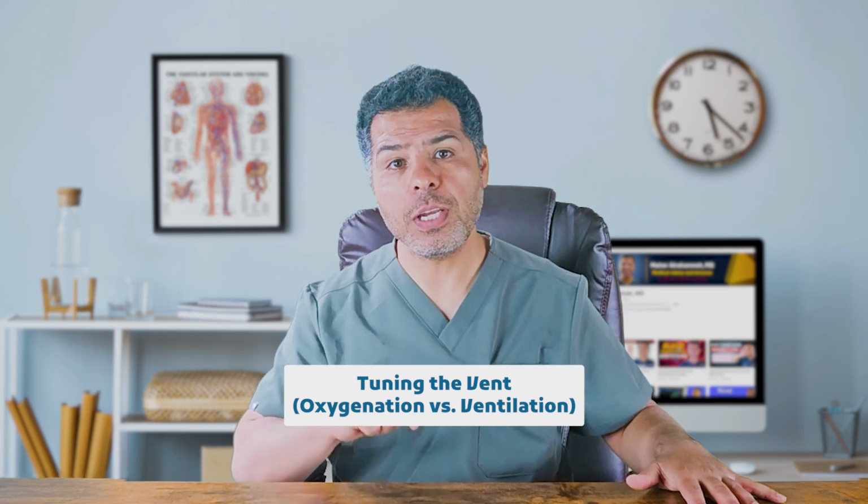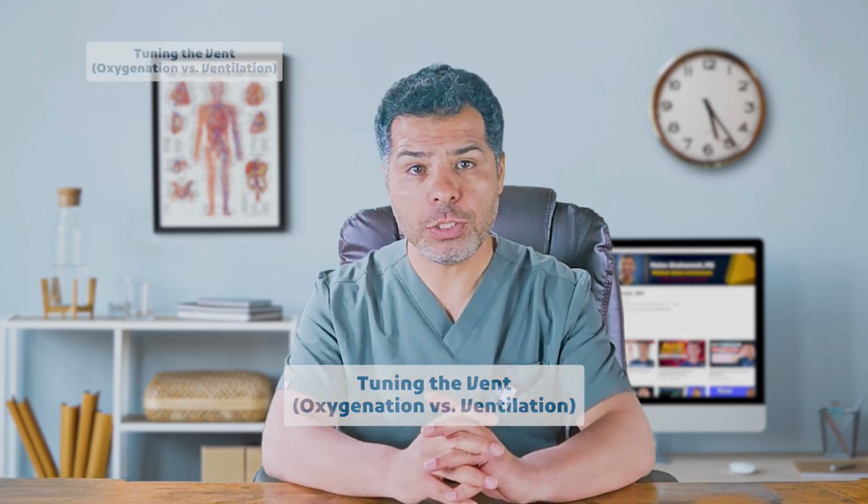Let's move to the final and ninth concept: tuning the ventilator, oxygenation versus ventilation. When managing a ventilated patient, it's crucial to understand what you are trying to fix. Are you trying to improve oxygenation, ventilation, or both?